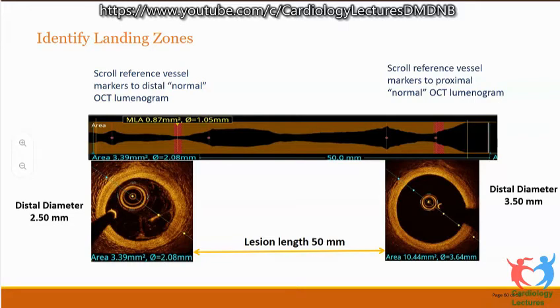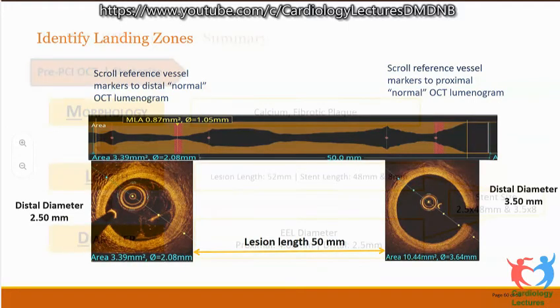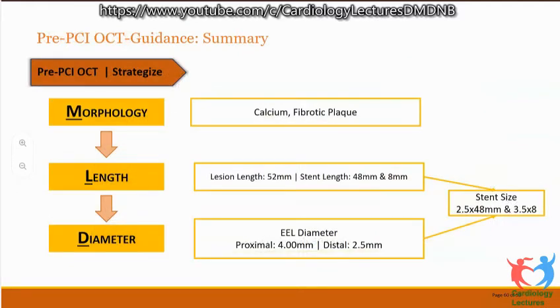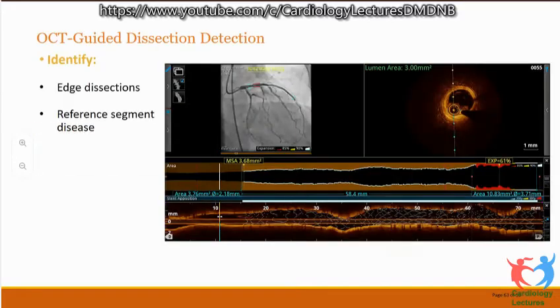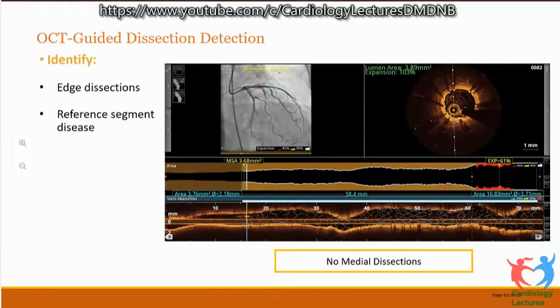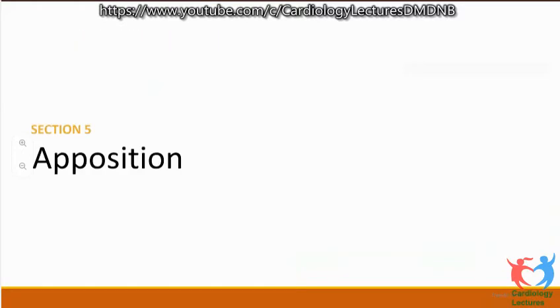As the lesion length here was long, we set stents of 2.5 by 48 and 3.5 by 8 so that we should be able to post dilate. The proximal EEL was coming to around 4 millimeter. That 3.5 can be dilated to 4 millimeters comfortably. Now post-implant, since the stent had come a little bit in segment, there was, as you can see, some amount of malapposition in there. And the indicator also tells that there is some amount of under-expansion.